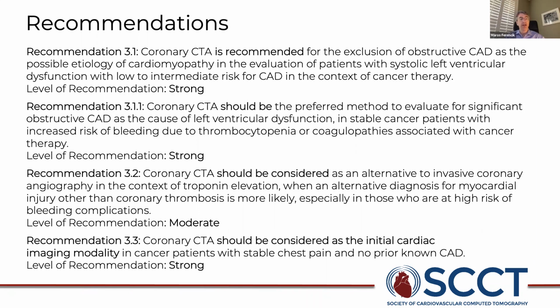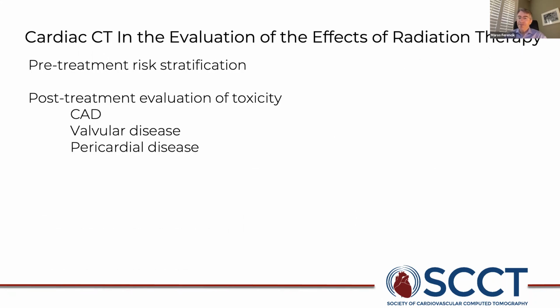And finally, recommendation 3.3 is that coronary CTA should be considered as the initial cardiac imaging modality in patients with stable chest pain and no prior known CAD, consistent with the most recent ACC/AHA guideline. Juan, you go next. Definitely.